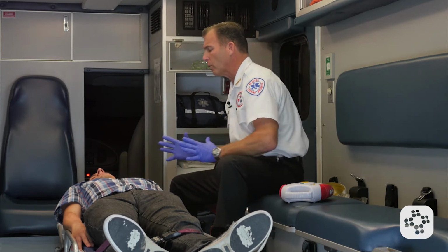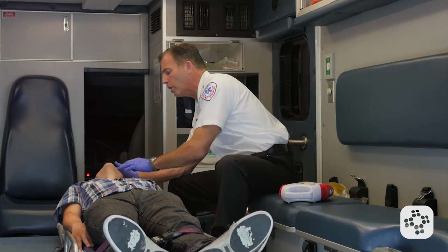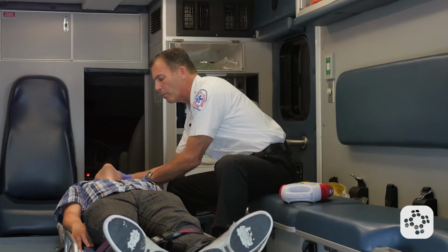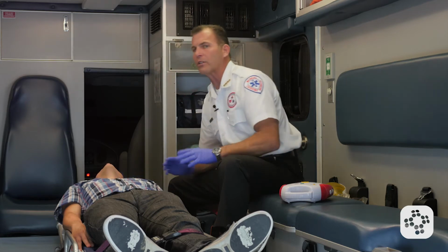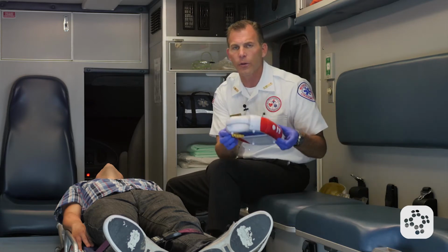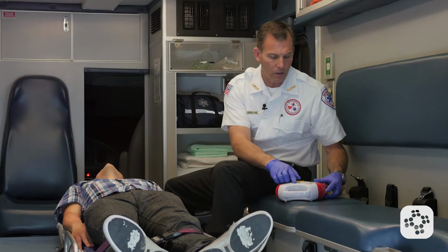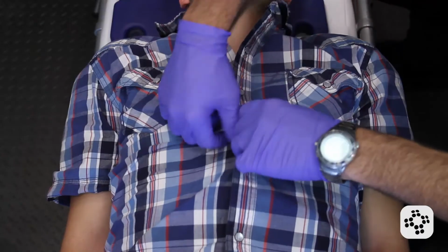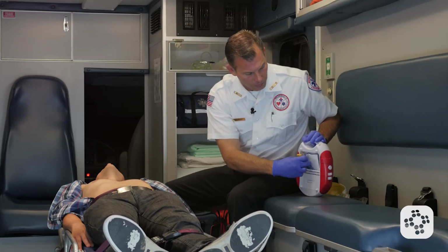But now we have 911 on the way, so I'm able to assess my patient for normal breathing, and I'm going to check for a carotid pulse for no more than 10 seconds. I do not see any normal breathing, and this patient is unresponsive and does not have a pulse. Because I have my automated external defibrillator here with me now, I'm going to turn it on first thing. Remove clothing from person's chest. I remove the clothing so I have a bare chest to work with.